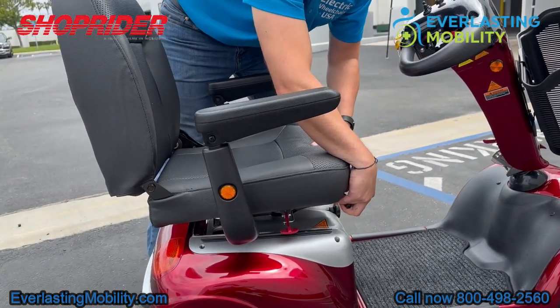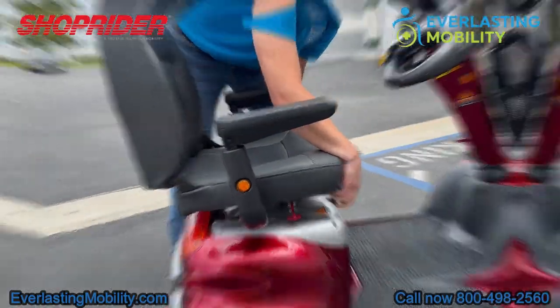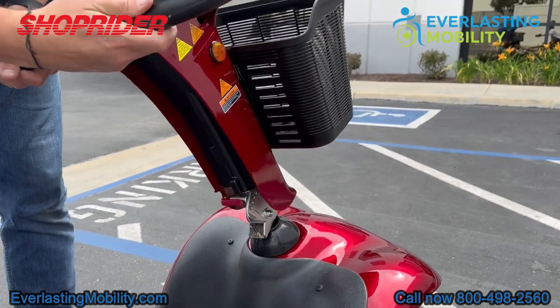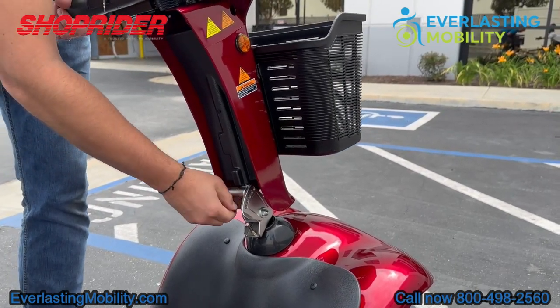The seat is also adjustable forwards or backwards, so you can slide it forward to get a comfortable driving position. In addition to that, the tiller is also adjustable. You loosen the lever at the base of the tiller, and once you get to a position that's comfortable for you, you lock it into place.